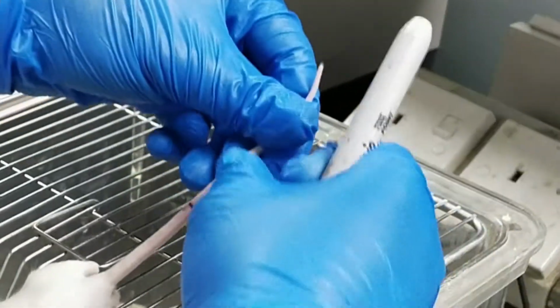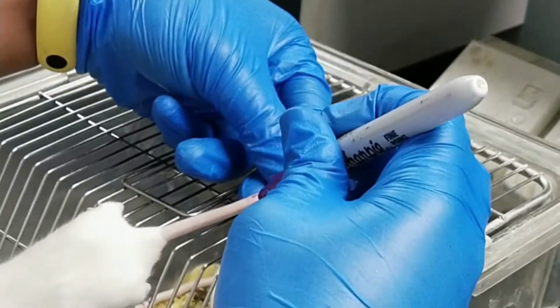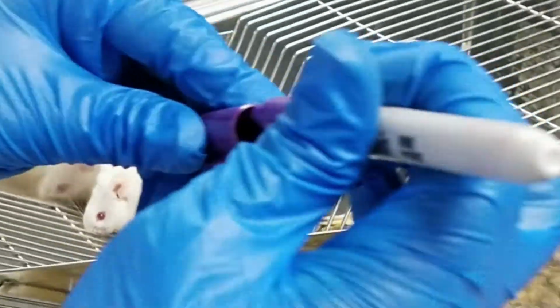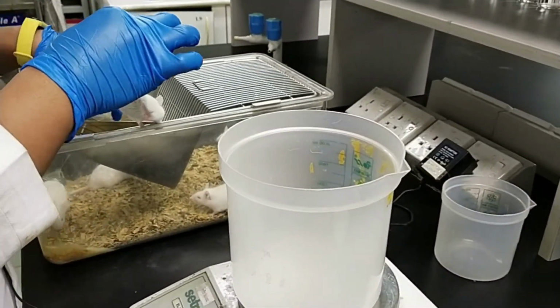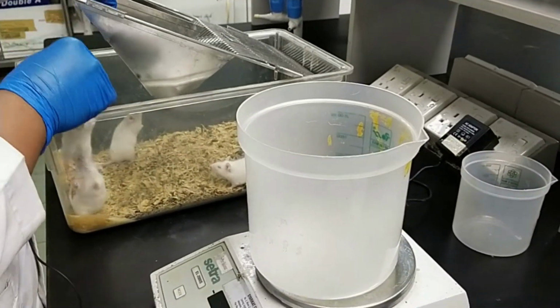Because this is mice number 1, we're going to label it as line 1, like that. So this one indicates mice number 1. And also we're going to proceed with mice number 2 for the subcutaneous injection, number 3 for the IM, and number 4 for the IP.